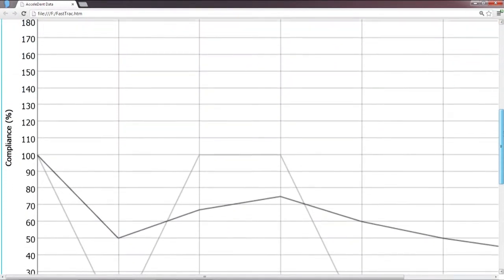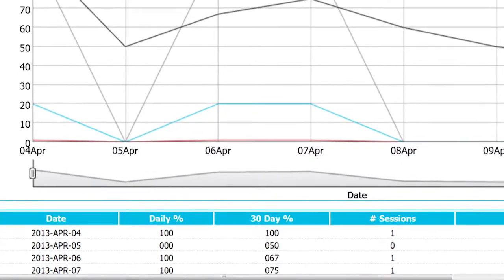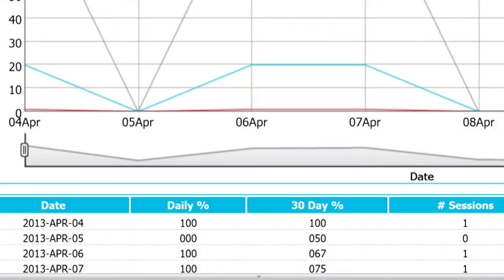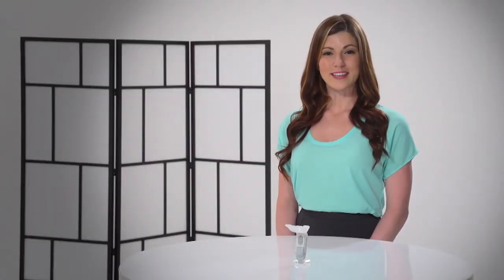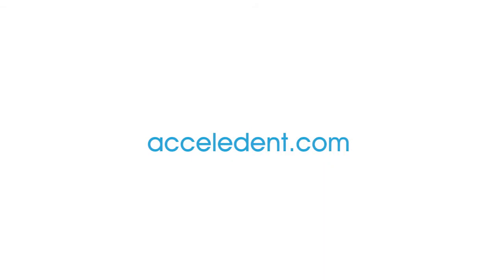This report displays the patient's usage history, as well as a daily usage graph and a daily usage table showing the date of each session and minutes per session. If you have questions about Accelident, contact your orthodontist or visit us at Accelident.com.